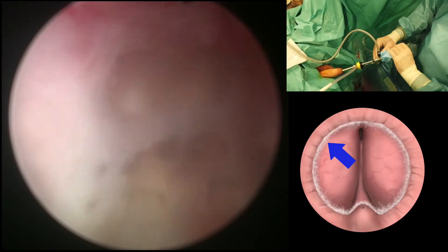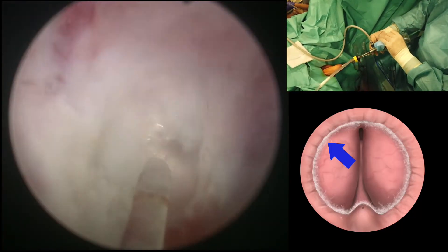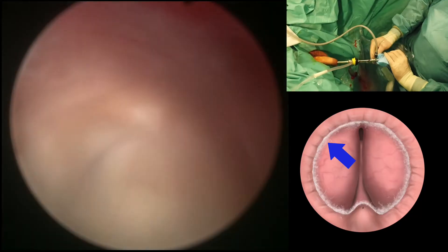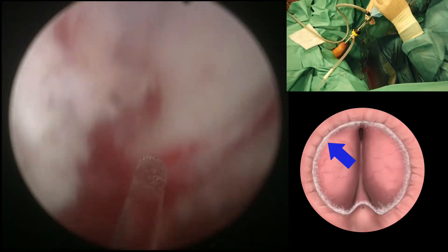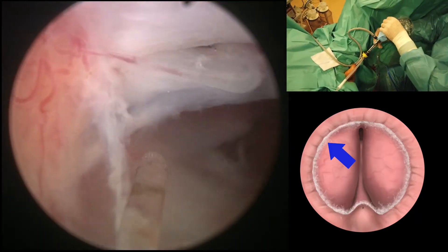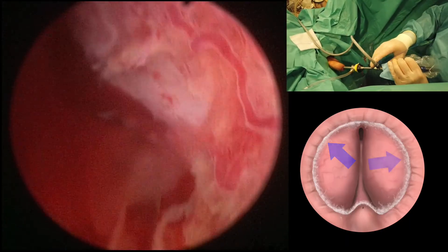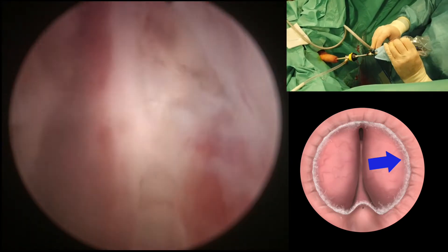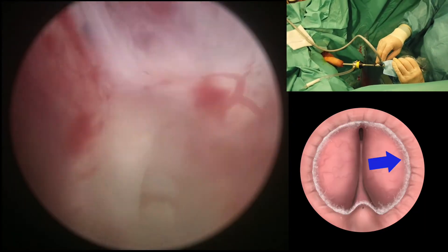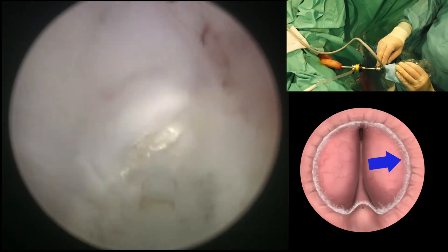The wonderful aspect of this approach is that we will preserve the sphincter's mucosa and that will provide the patient with immediate perfect continence, and it will reduce the chance of temporary stress urinary incontinence that we have seen with the classic technique. In the classic technique, the dissection of the lateral lobe at the apex is carried out without even looking at the sphincter and often it results in the de-epithelization of the sphincter.